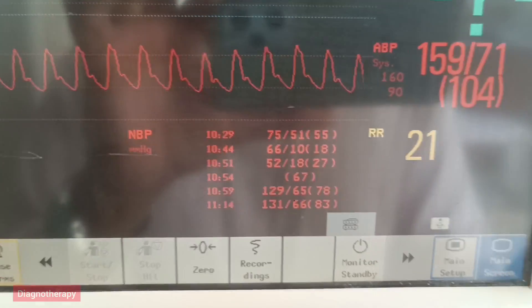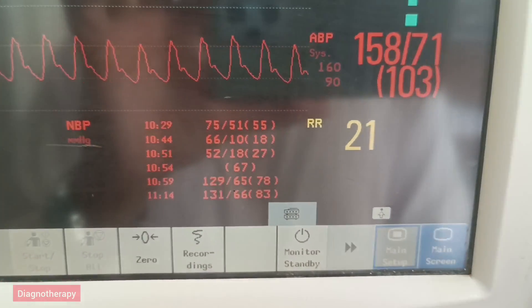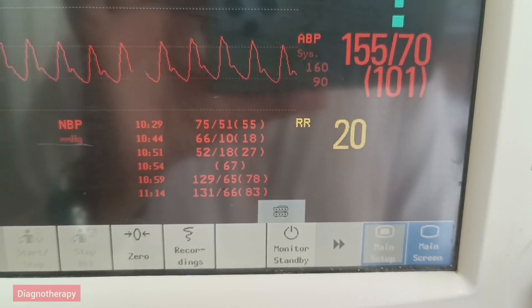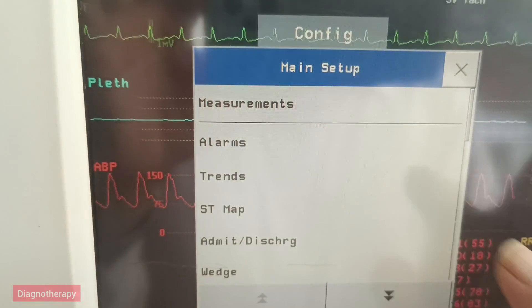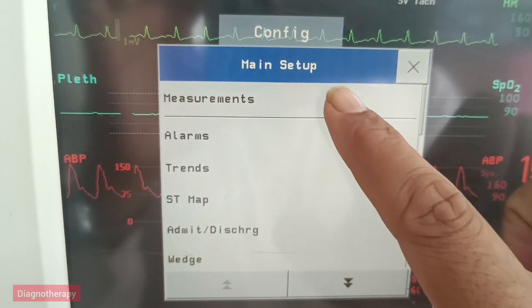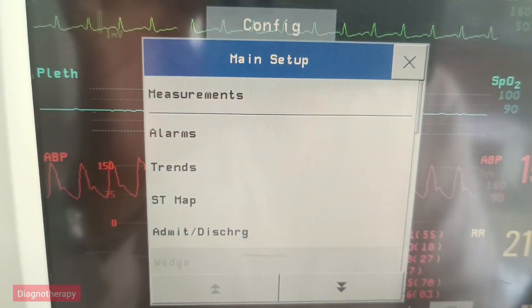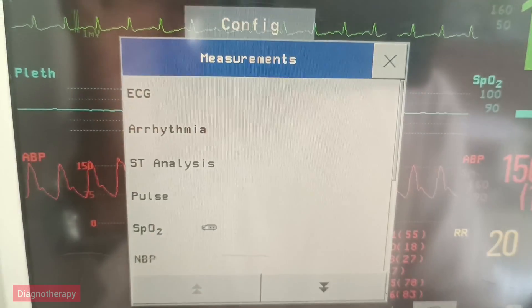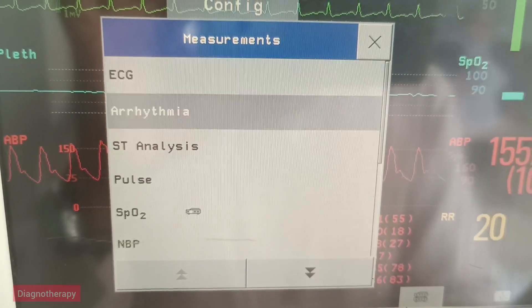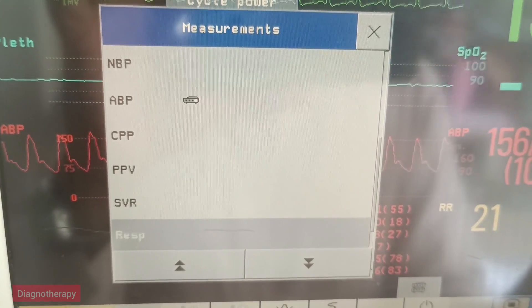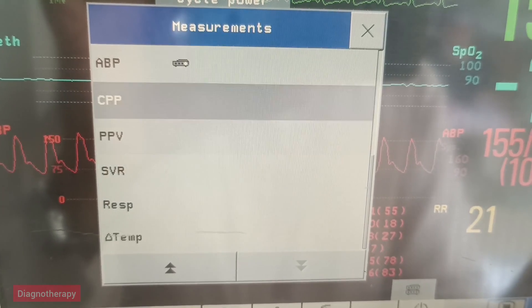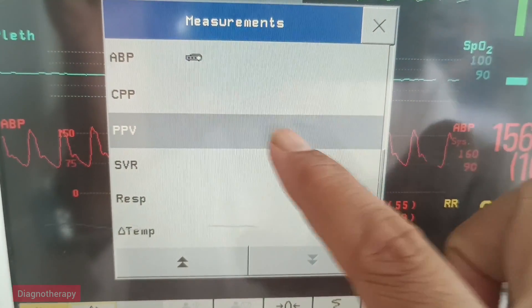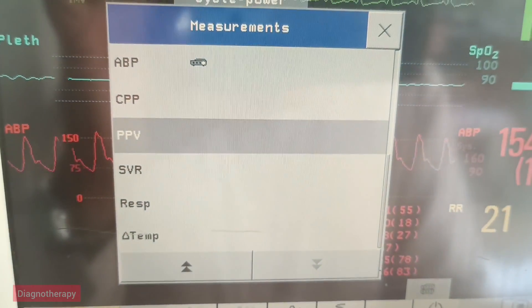Then you need to again go to main setup. You can see now you need to scroll down and go to measurements. In measurements, scroll down then select PPV — pulse pressure variation — this one.